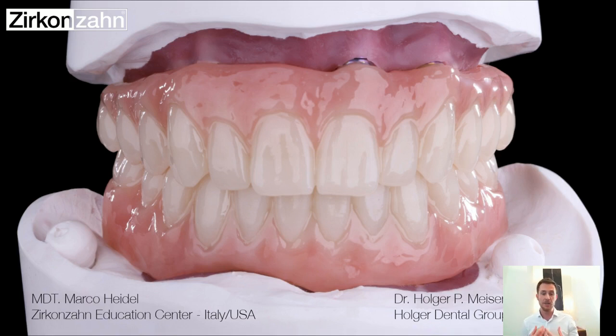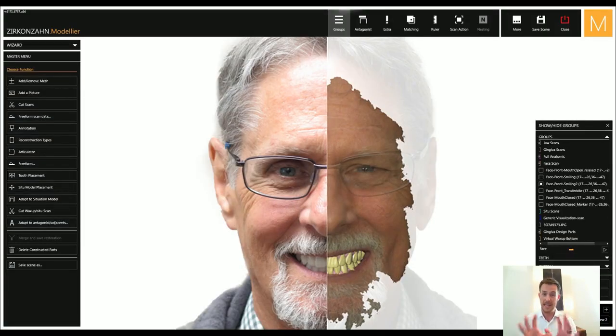But I save a lot of time beforehand because I don't have to start afterwards with the tooth placement, with the gingiva design. I save a lot of time with that, yeah? And this is now the final situation. It's just wrapped a little bit of composite around, that's it. Here I also milled a multi-stratum flexible, and well, this is the prototype. And this prototype does fit into the patient's mouth very well.